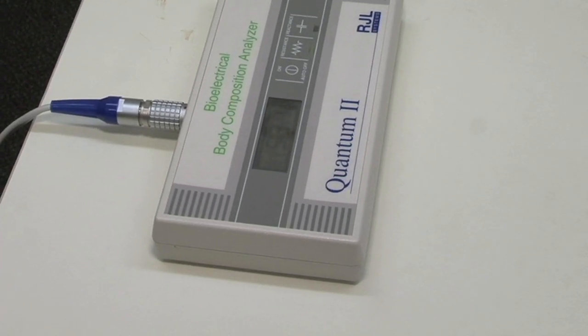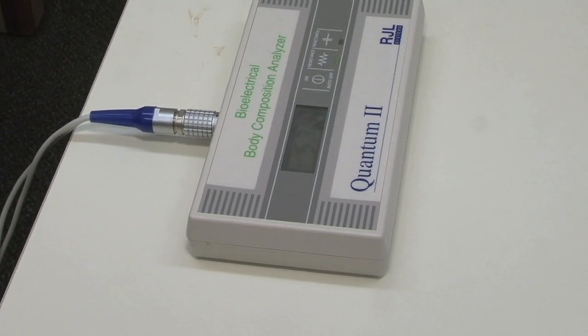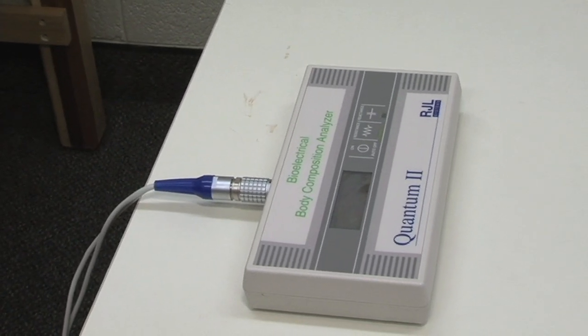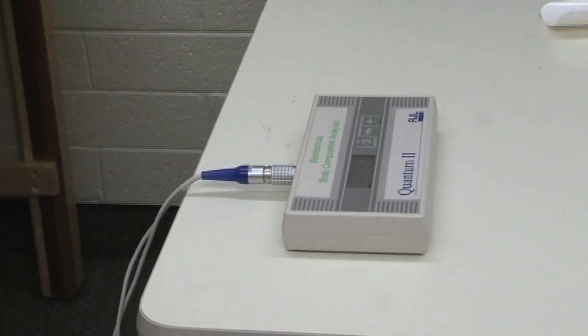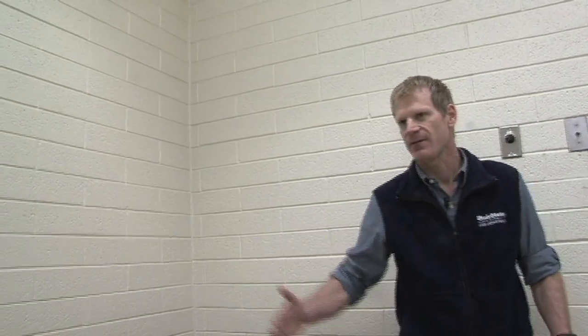That number in and of itself doesn't mean anything, but we take that information and put it into an equation. Other information we need for the equation is her height. Height is critically important because, as with any electrical current, the resistance is dependent on the height and the cross-sectional area of the cylinder. In this case, the electrical current is going through her arm, down the side of her body, and over to her legs — so we're really measuring the whole body, or half the body, and then making a prediction based on that measurement.